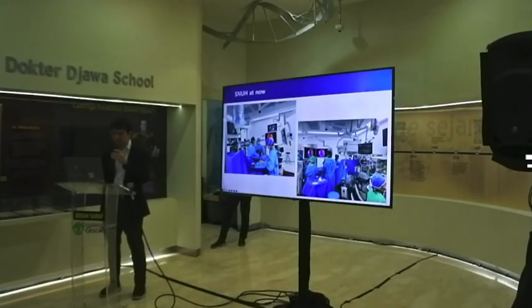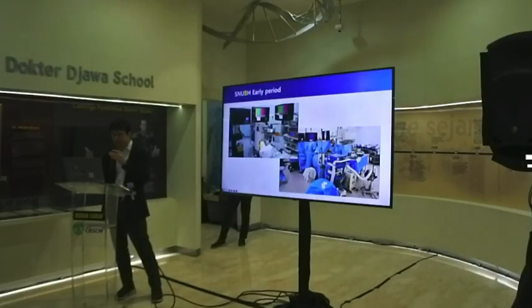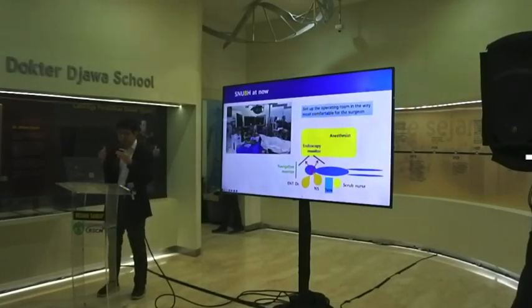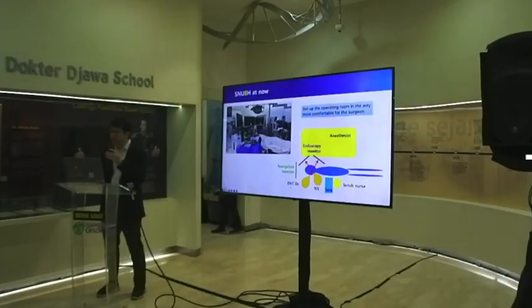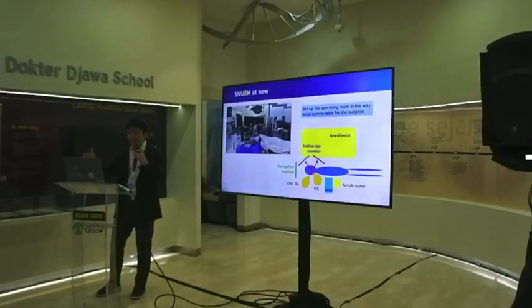And this is the operating room preparation at Seoul National University Hospital. And this is Bundang Hospital, my operating room. At first, we had the face-to-face alignment. But actually, I changed the operating field to the linear alignment because our anesthesiology team had difficulty managing the air circuit.